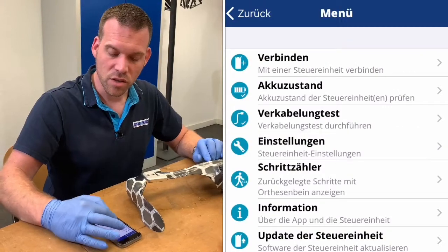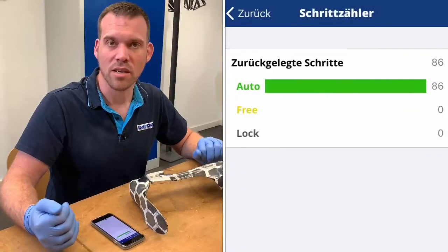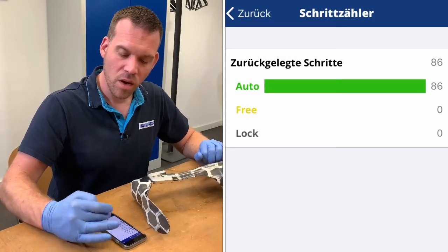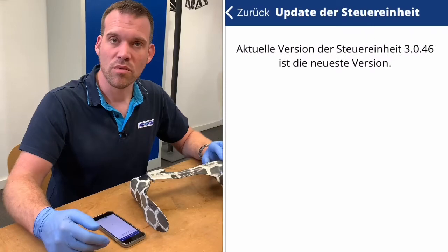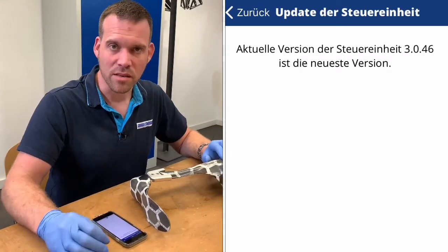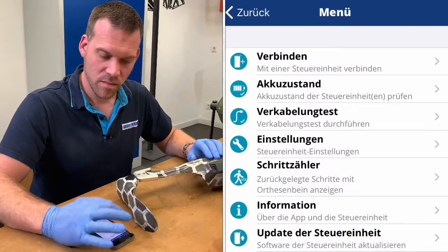We can check the step counter and read out the steps taken so far. And we can check if an update is available for the controller — in this case the latest version is being used and an update is not necessary. These steps should definitely be part of any comprehensive maintenance of the neurotronic.